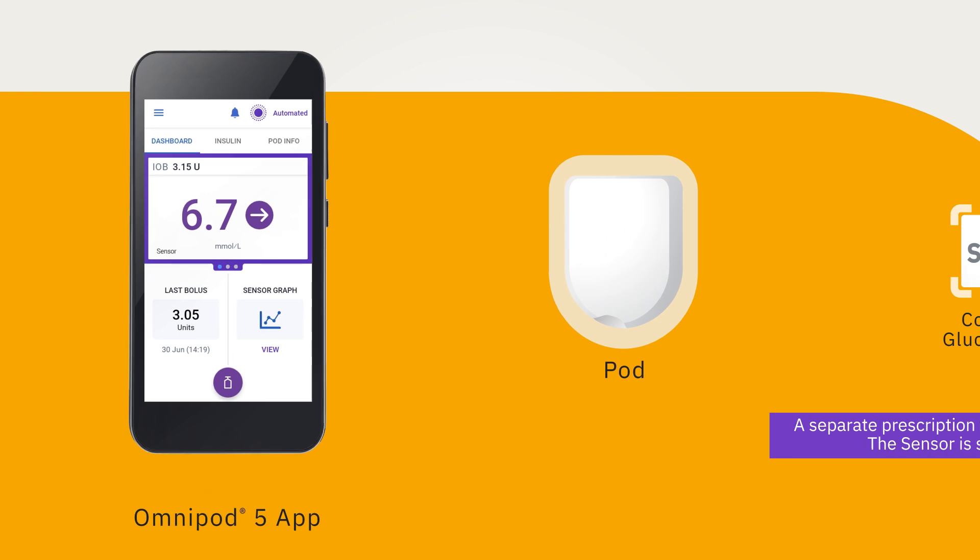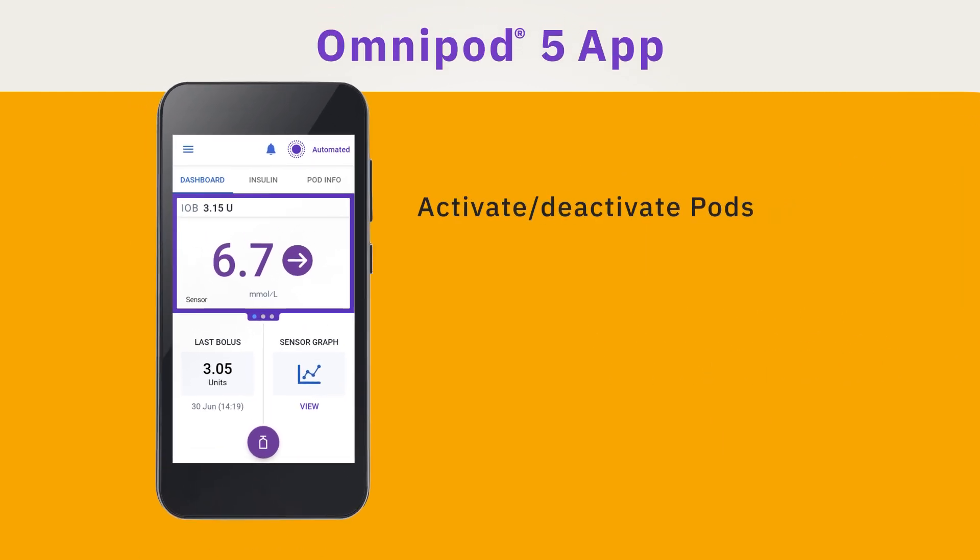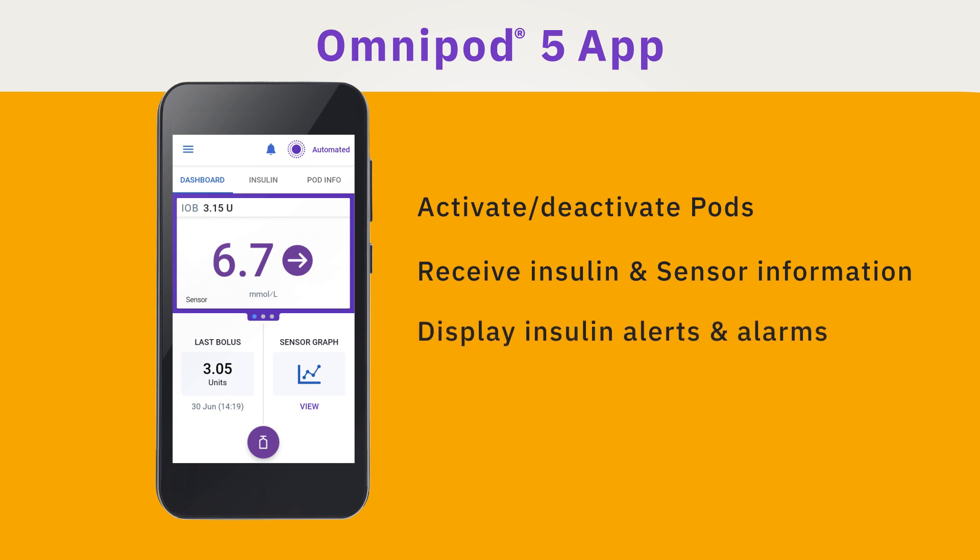The Omnipod 5 app is used to activate your pod, receive insulin and sensor information, display glucose, insulin alerts and alarms, and issue meal and correction boluses.